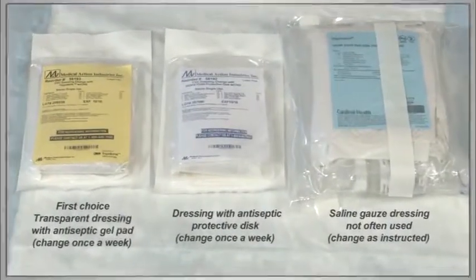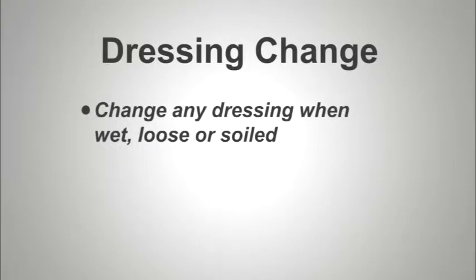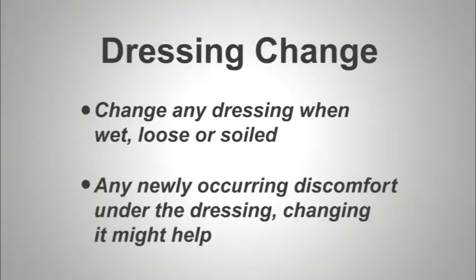Now let's discuss the CVC dressing change. The dressing change needs to be done once or twice a week, depending on the type of dressing that you will use. Your nurse will tell you which dressing is right for you. You should also change the dressing as soon as possible if it is wet, loose, or soiled. If there is any newly occurring discomfort under the dressing, changing it might help.